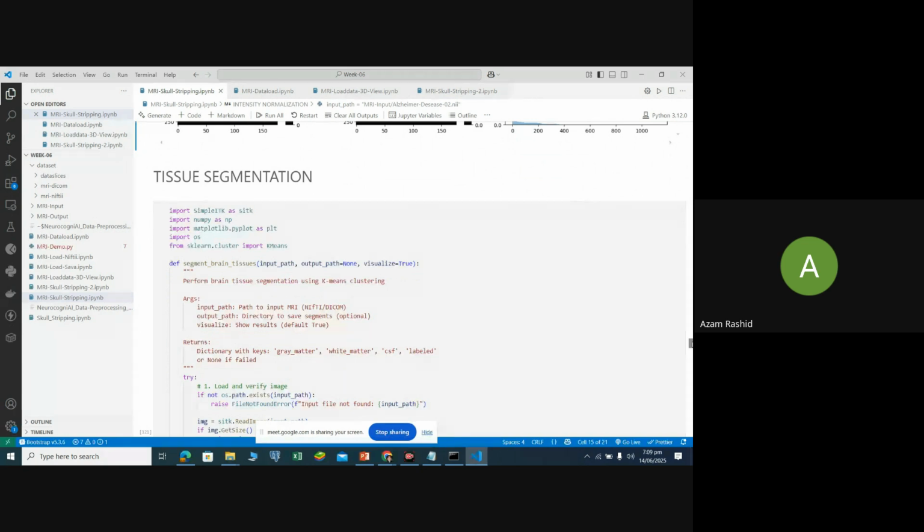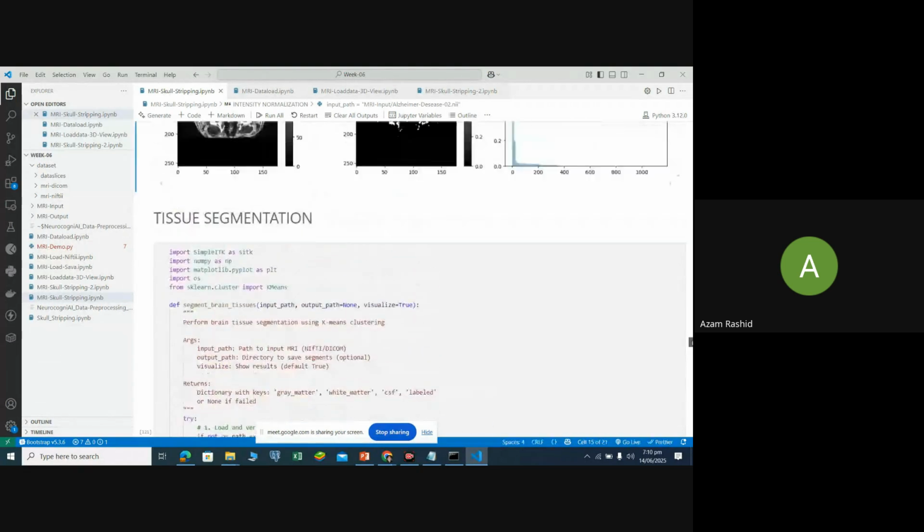Feature extraction is just like tissue segmentation in our case, because this is the main part where we get the tissues, the values of the tissues, and the nature and shape of the tissues. After experimentally taking different images, we train our model, and when we upload an unseen MRI, our model detects it and also explains which tissue parts indicate early Alzheimer's detection.